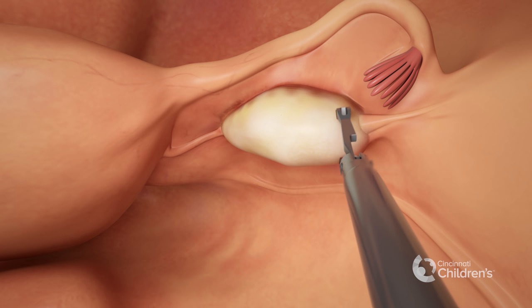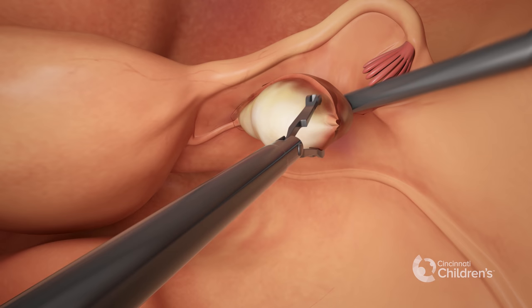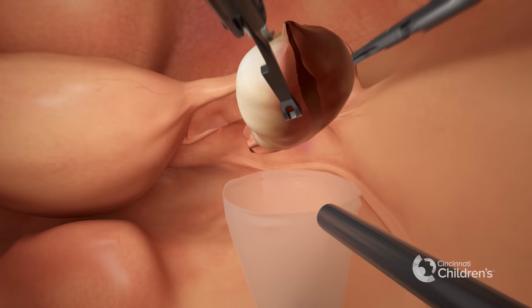The ovary is grasped and a surgical energy device is used to separate the ovary from the fallopian tube. The ovary is then placed into a pouch and removed from the abdomen.